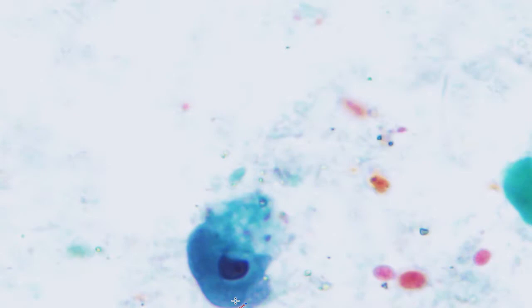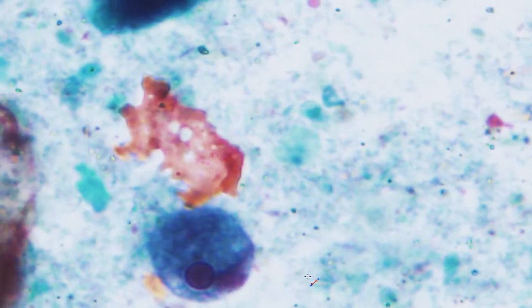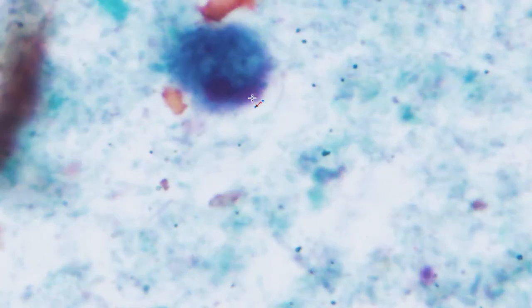Here's another nice one here. So, very eccentric karyosome, and slightly uneven peripheral chromatin, much heavier there than it is there. So once again, I'm thinking this is Entamoeba coli. Keep on moving, looking. I would, of course, measure these where I could as I went. If I was at all unsure about the morphology, I could use measurement to assist me in making a final decision. Here we have another one.